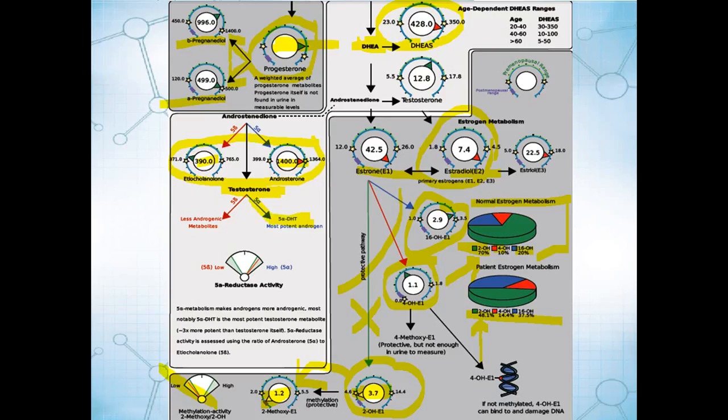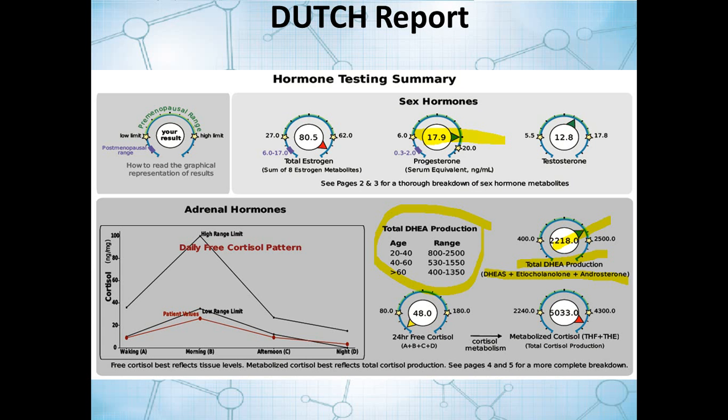So to look at that, we look at the 5-alpha metabolites versus the 5-beta and just look and see who's winning this battle. In this case, it's heavy down the 5-alpha pathway, which would then imply that at a tissue level, let's say in a hair follicle, testosterone's going to move to DHT fairly readily, and that's something that you can address. So that's what that section is for.